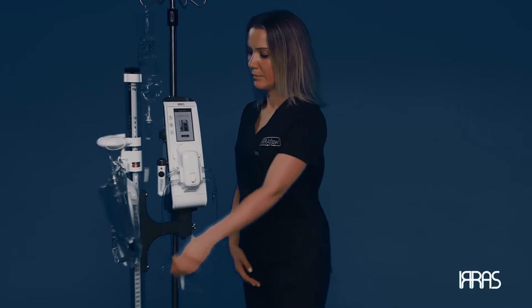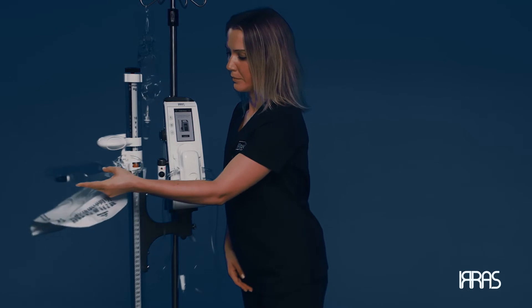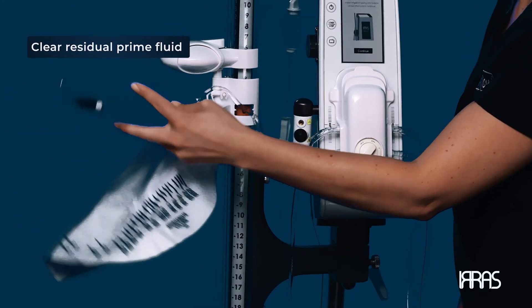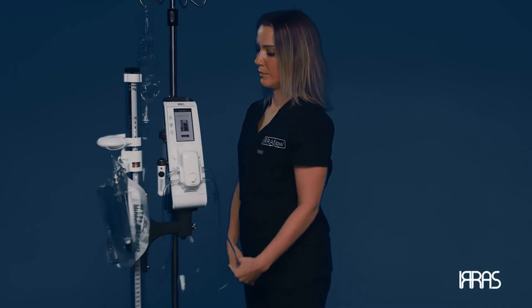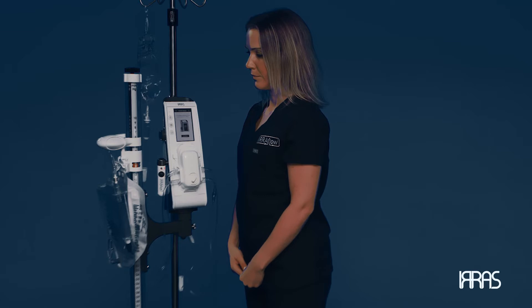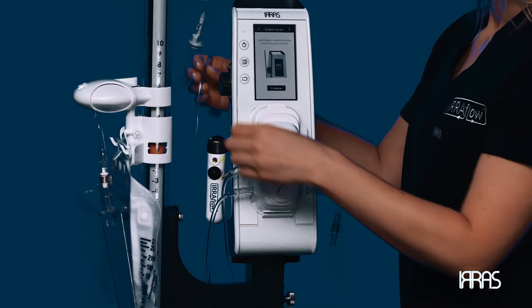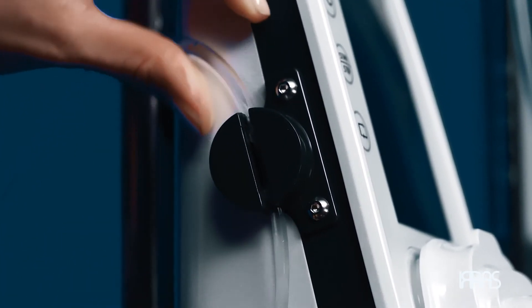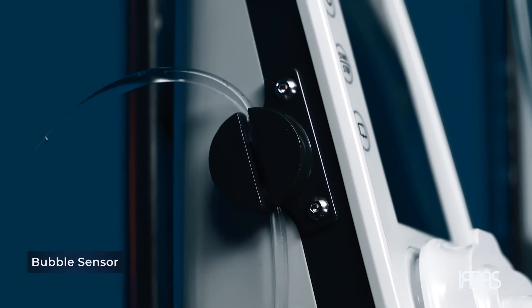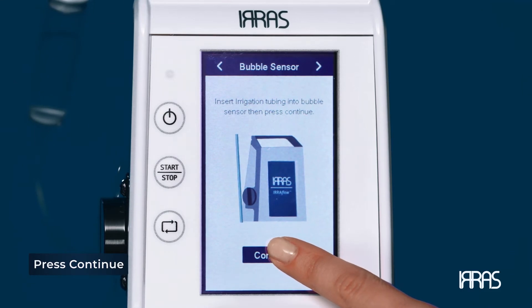To prevent residual fluid from being accounted for as output during patient treatment, pour the residual prime fluid into the large portion of the drainage collection bag. Now that the system is primed, place the irrigation tubing into the bubble sensor, making sure the tubing is fully inserted. This ensures no sizable air bubbles are introduced into the system via the IV bag. Once completed, press the continue button on the screen.